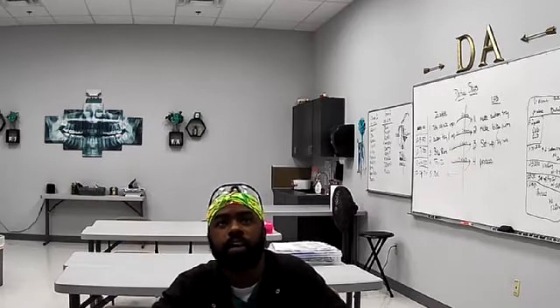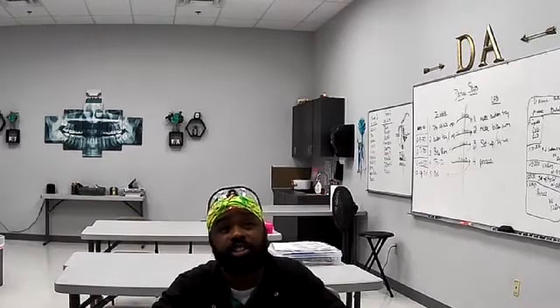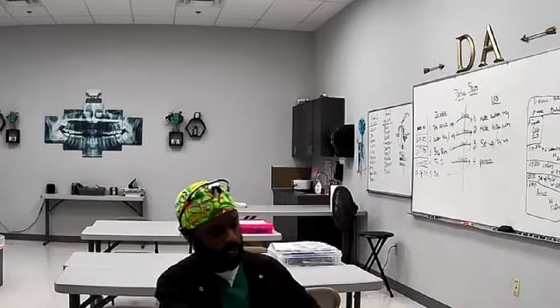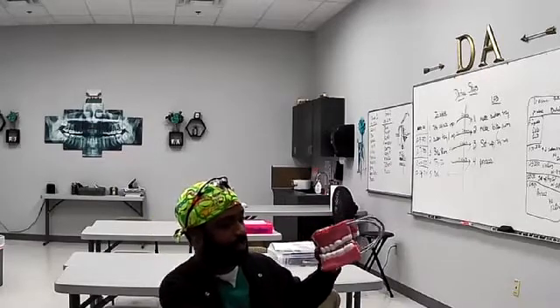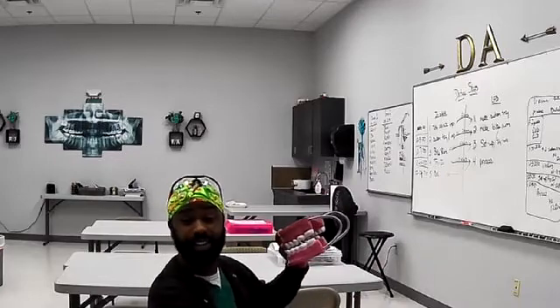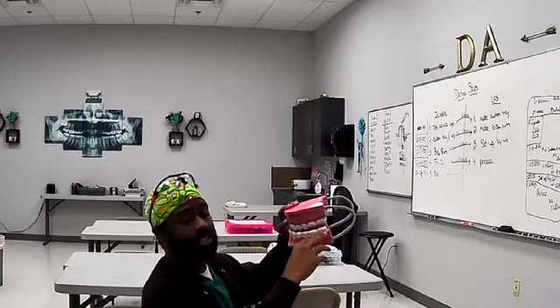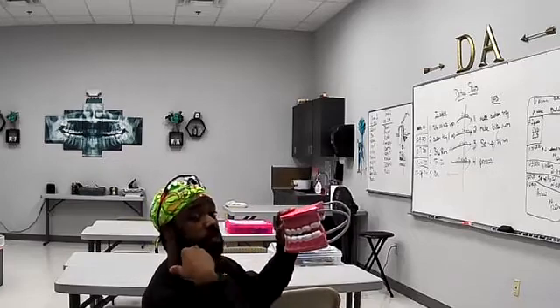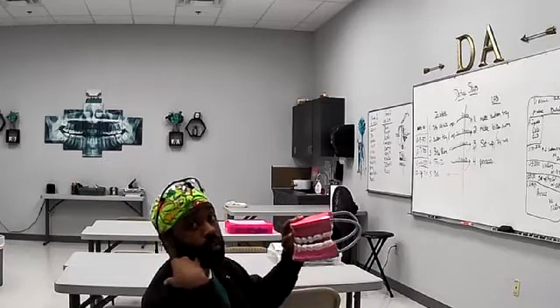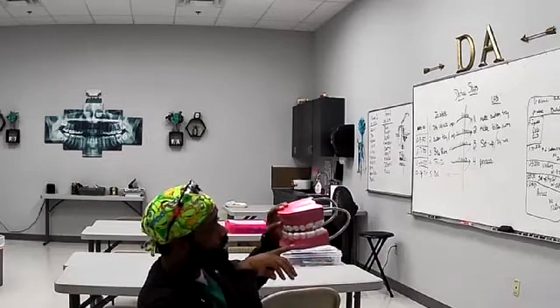They also help dentists detect changes to your jawbones, especially changes caused by gum diseases. Whenever you take your bite wing, you'll be able to see the natural line of the jawbone. But if the patient has severe decay, to the point they've needed a root canal for a year and just let it go, it's going to start to deteriorate their bones. So that infection down below is not only messing with the tooth and the surrounding areas of the gums, it's also down in the bone. Okay? And it would literally start deteriorating.